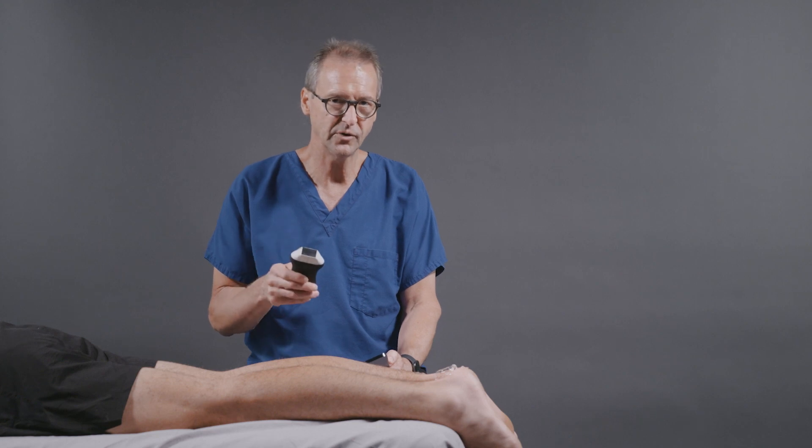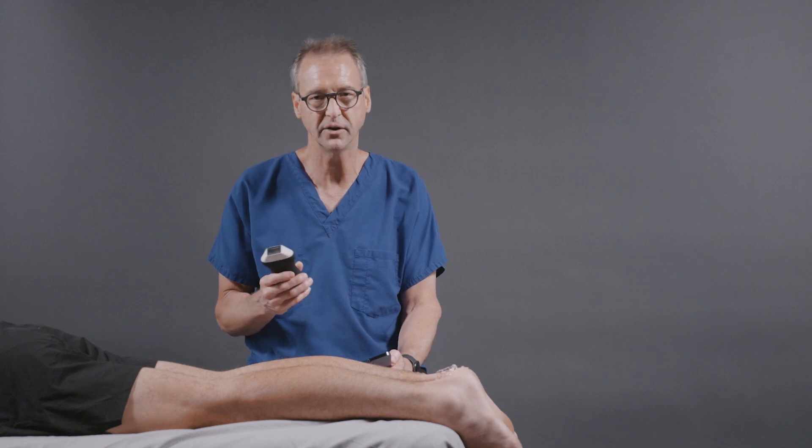To do this examination, use a linear transducer. We're going to use Clares' new transducer called the PALHD3. PAL is an acronym for phased array and linear array, and the transducer has the capability of being used in both the phased array or the linear array setting, which allows you to examine just about every area of the body that you would with any other type of system.